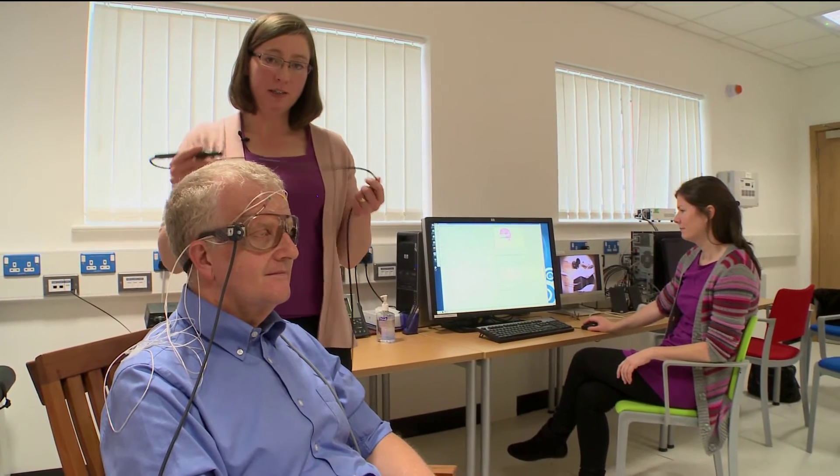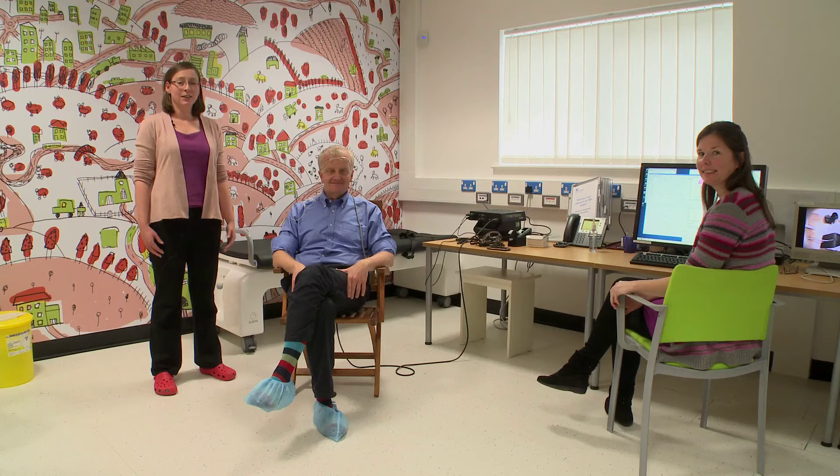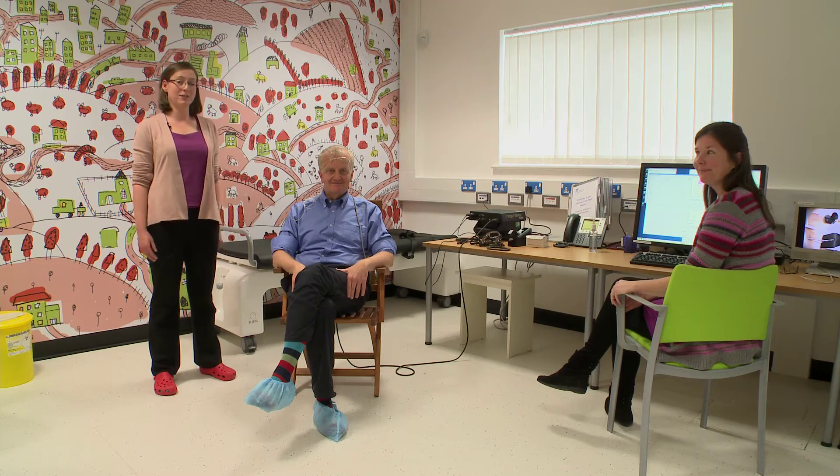We've now finished the process of measuring the shape of Stefano's head, and that information goes from this pen to the computer. We use this to find out whereabouts in the brain the seizures are coming from. Now we're all finished with our preparations and it's time to take Stefano through into the MEG scanner.